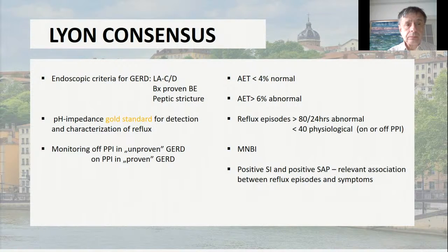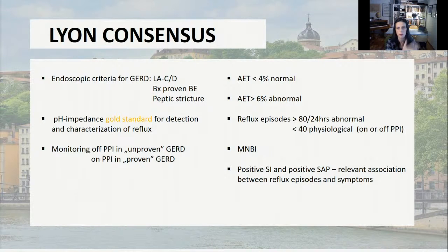Slažem se. A što se tiče postavljanja samog katetera, postoje neke formule napisane u studijama ako nemamo zabilježenu Z-liniju gdje se nalazi. Orijentirate li se više prema Z-liniji na gastroskopiji ili radiološkim metodama evaluacije pozicije katetera, ili po formuli koju ja možda najčešće koristim jer je najjednostavnija?